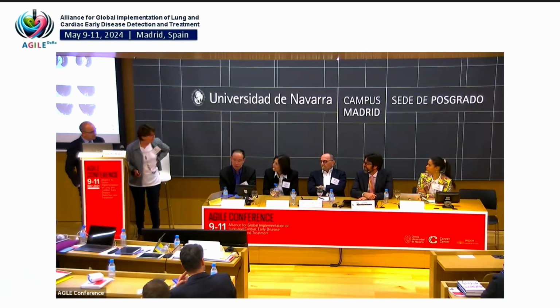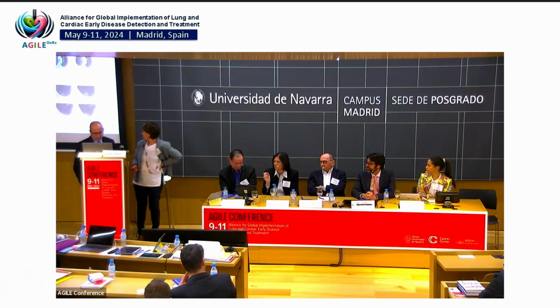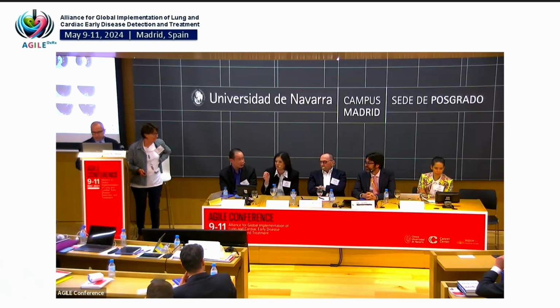Okay. Anyone else has another opinion, or would you like to support this? Guillermo wants to say something. Yes. I was going to say, there is one nodule that seems to be big, dominant compared to the rest. So I think that's what everybody seems to be concerned about. It's very small in terms of doing a needle biopsy. I would refer to my pulmonary medicine colleagues who would probably want to approach it. They have the ability to do cultures and bronchoalveolar lavage at the same time. So it may still very well be infection. The dominant nodule just makes you a little bit more concerned.